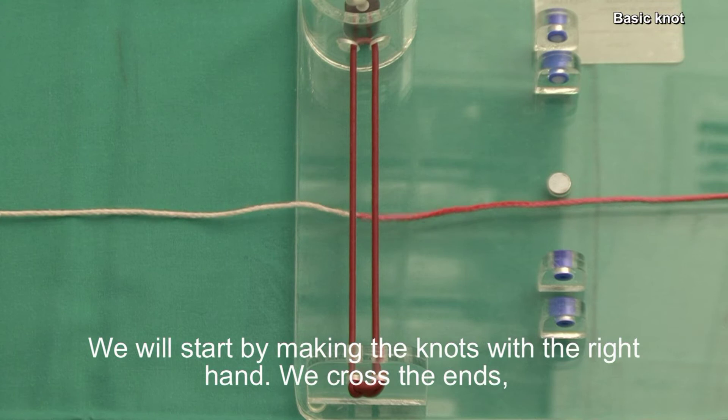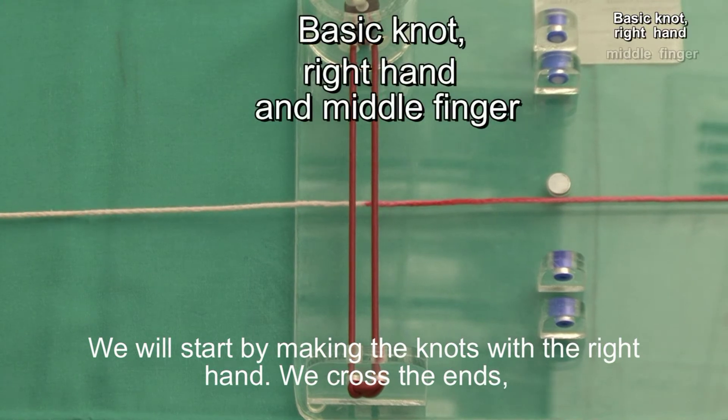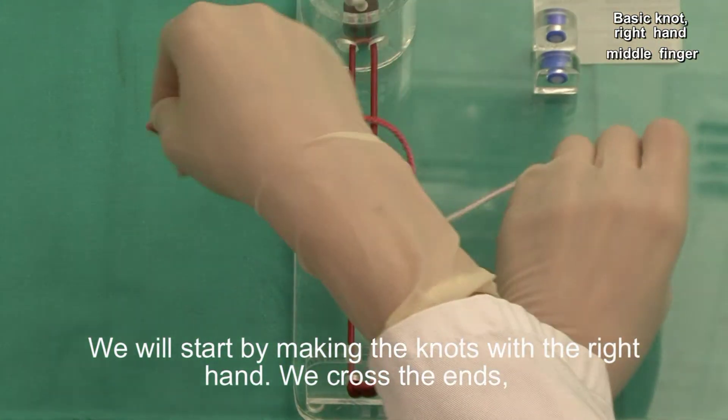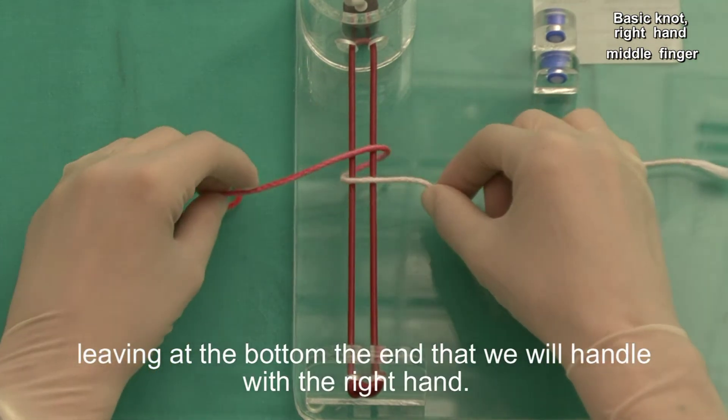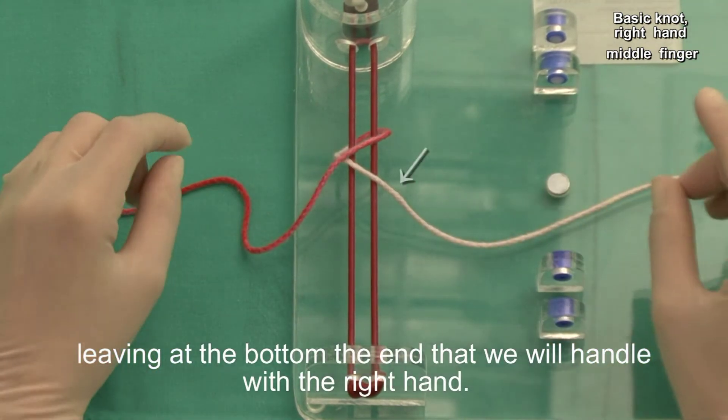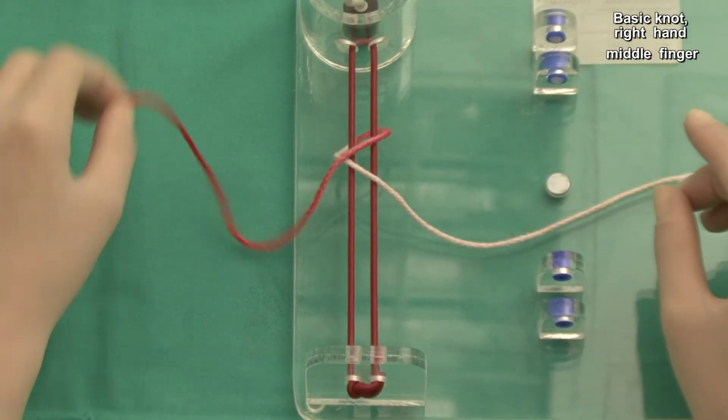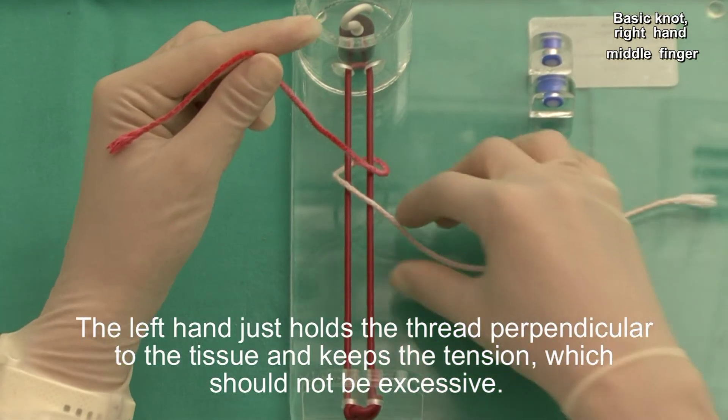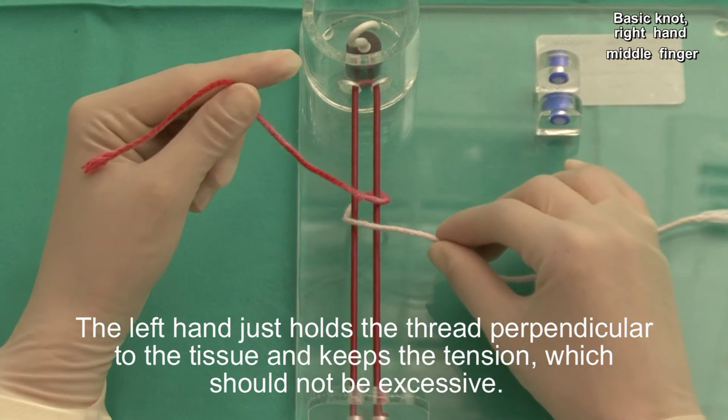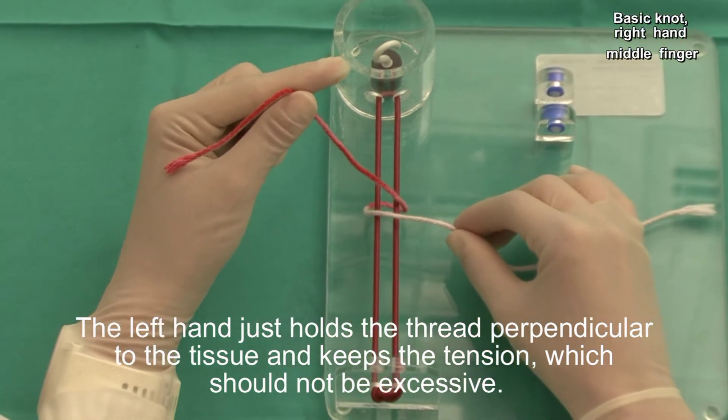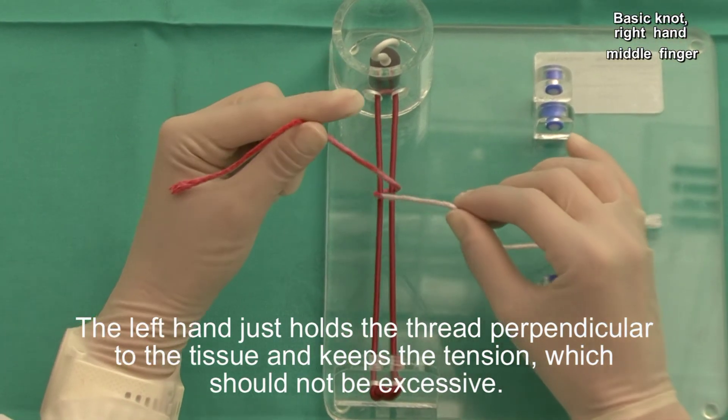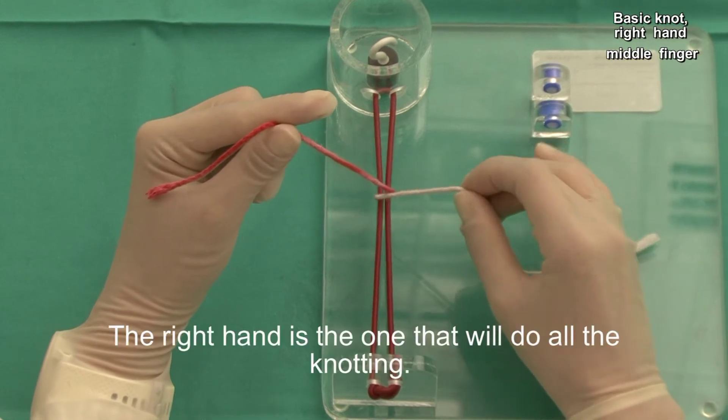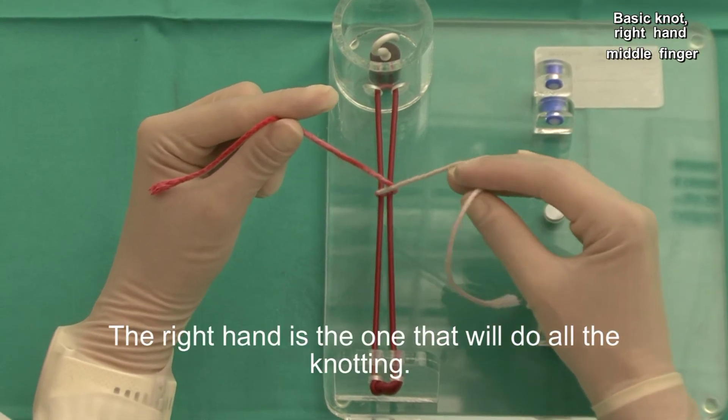We will start by making the knots with the right hand. We cross the ends, leaving at the bottom the end that we will handle with the right hand. The left hand just holds the thread perpendicular to the tissue and keeps the tension, which should not be excessive. The right hand is the one that will do all the knotting.